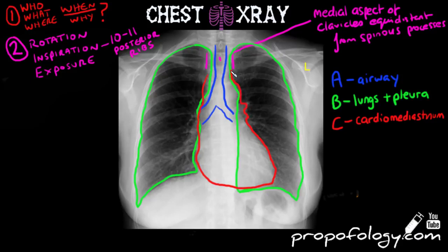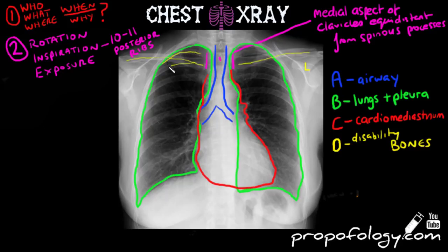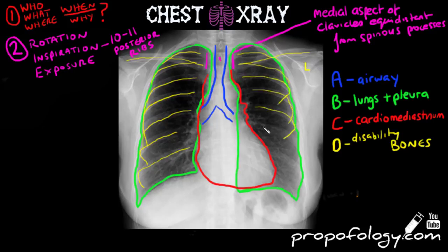We'll talk about some reference points for sizes of particular bits of the anatomy in a minute. Staying true to our ABCDE mnemonic, we're going to look at D — disability — which incorporates the bones. You're going to try to trace the clavicles, look at the spinous processes in the midline, and then work on the ribs — starting at the top and working your way down, starting at the posterior aspect of the ribs and working your way forward, looking for fractures or any displacement.